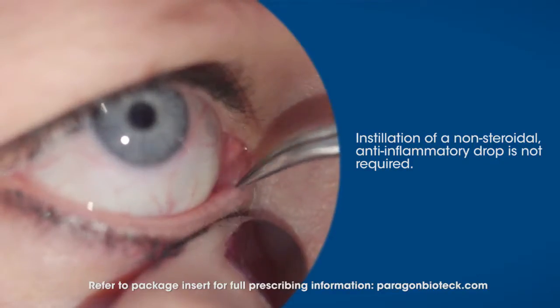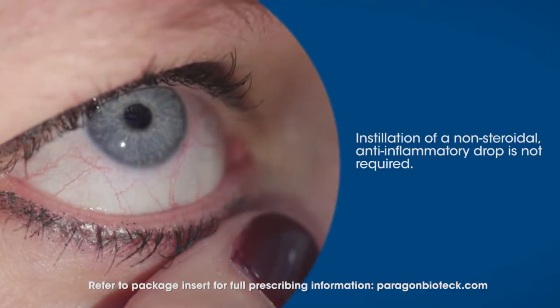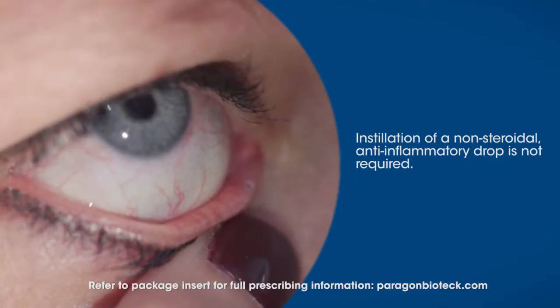While not required, you can use a drop of a non-steroidal anti-inflammatory in the eye to make sure the patient does not have any discomfort following the procedure.